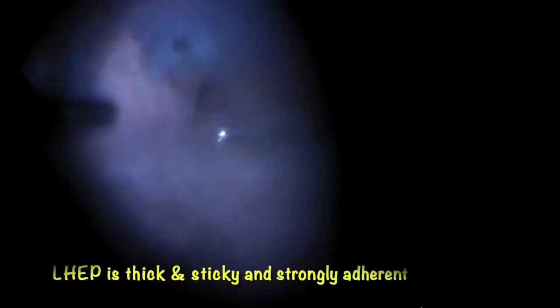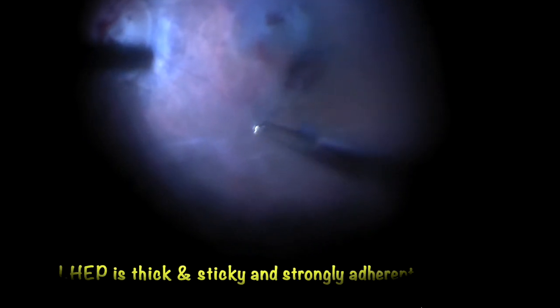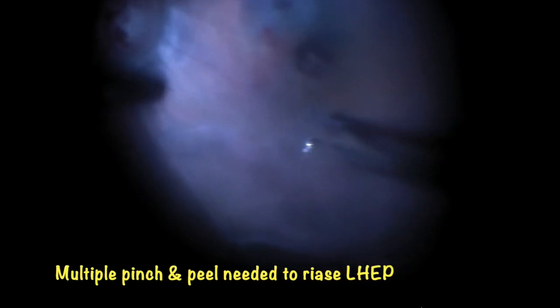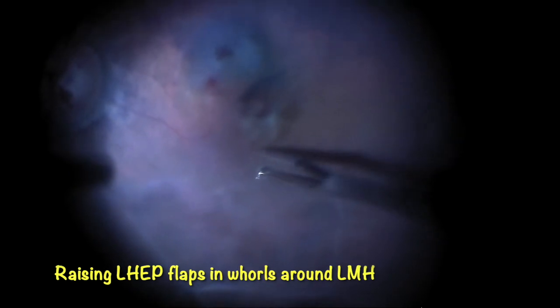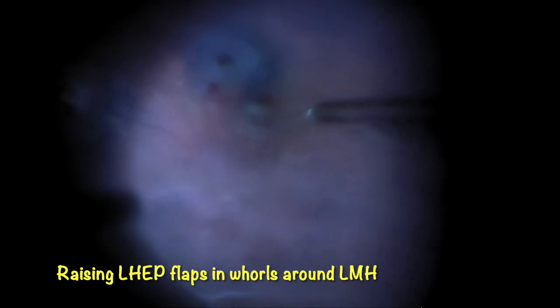The surgical steps are similar to those used for degenerative lamellar macular holes. In retinal vein occlusion, underlying retinal ischemia with poor state of photoreceptors due to chronic CME leading to lamellar macular hole portends a challenge for a good surgical outcome.